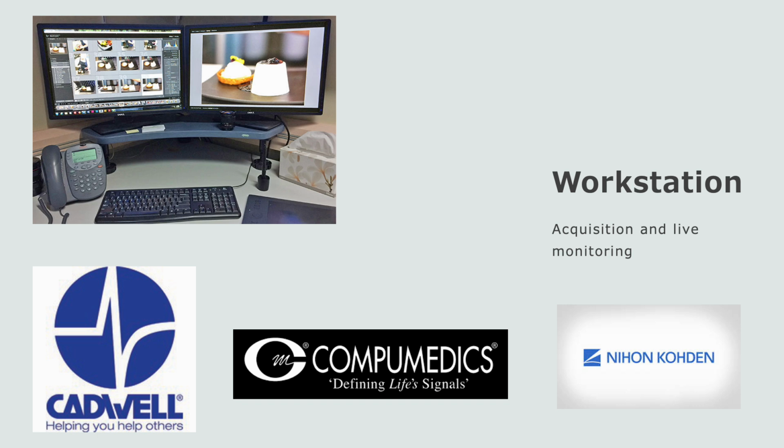At the workstation that controls the patient's room, it's common to have two monitors for one computer for the 2-to-1 tech ratio, and one computer is usually powerful enough to run two sleep studies at once. All you need is two monitors, and you've saved money on that extra computer.